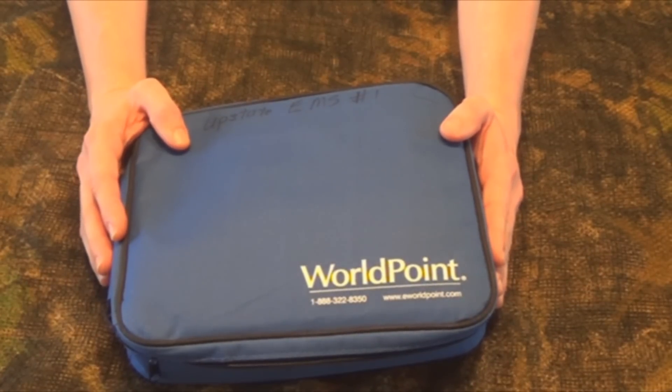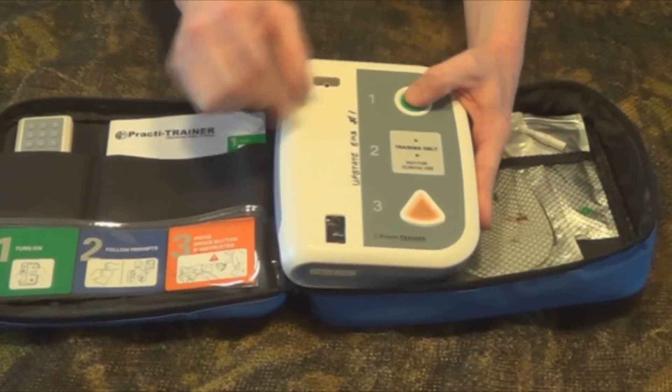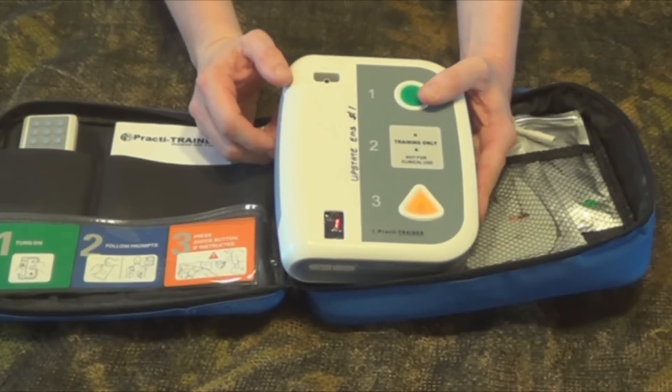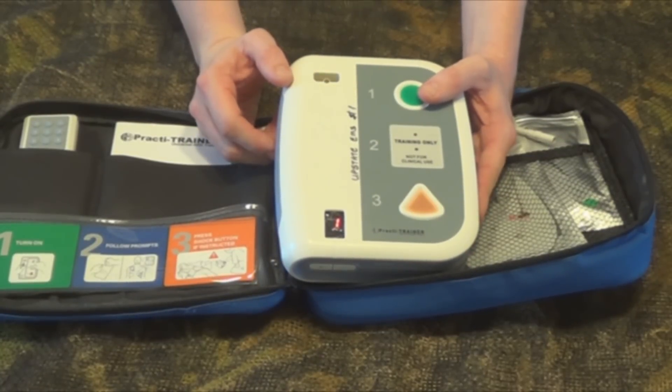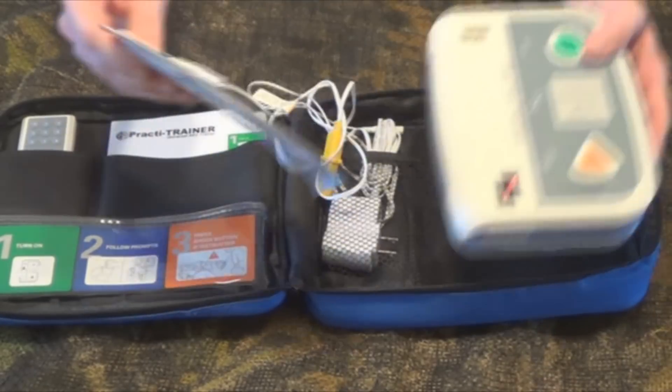Once the AED is turned on, it will talk you through how to use it. This particular one we do have to turn on — it has a green button, and you can see it's following the steps here. Apply pads to patient's bare chest. Plug in pads connector next to flashing light.